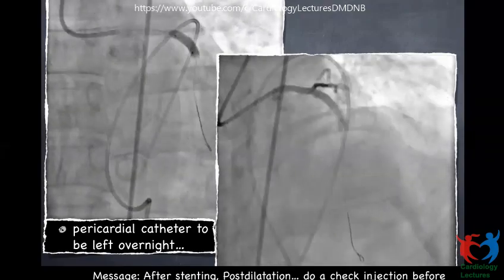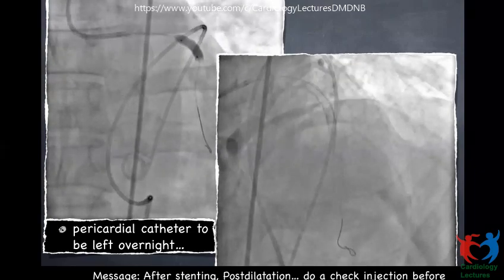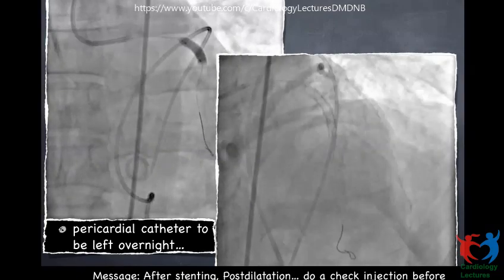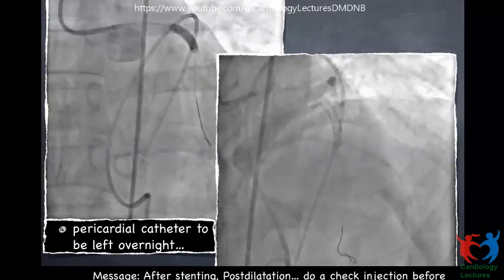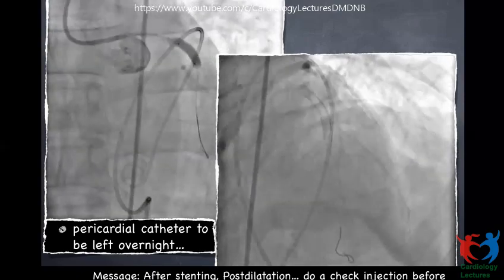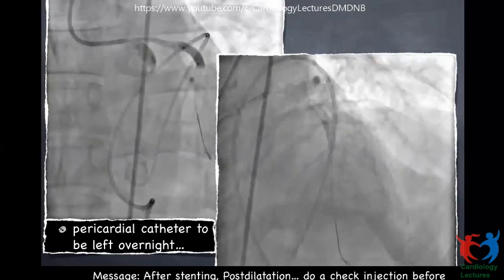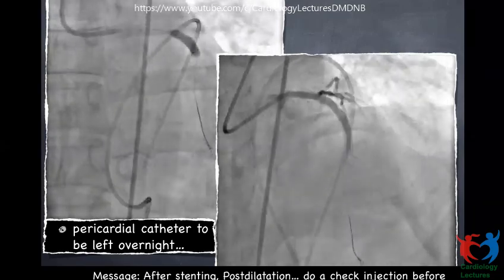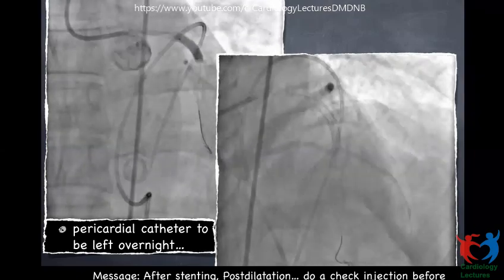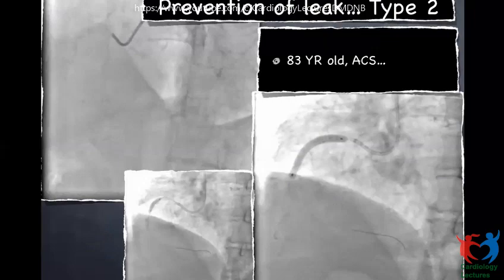Coming back to our patient, we used a 4 mm covered stent in the proximal LAD. We also had to post-dilate it, and finally we could seal the perforation and achieve flow inside the vessel. We left the pigtail catheter overnight and removed it the next day. Always do not remove the pigtail immediately — keep it overnight and make sure there is no further leak into the pericardium. The message: after stenting and post-dilatation, do a check injection before pulling out the balloon. If you see a perforation, immediately dilate the balloon there to avoid tamponade.